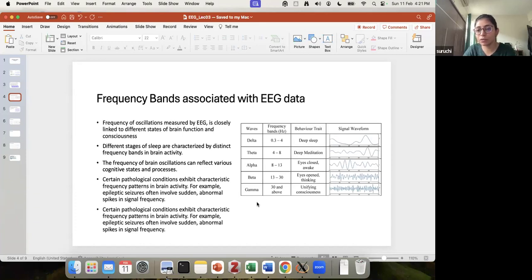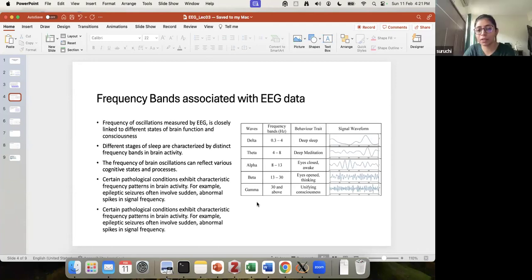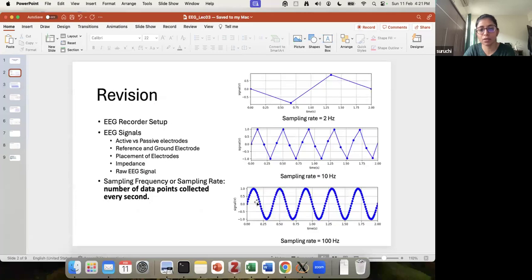So in terms of this, there's nothing to do with sampling rate here? No, nothing to do with sampling rate. Sampling rate is the measurement. Even if you took 10 samples per second and 100 samples per second, it is still 3 hertz. The signal frequency is still 3 hertz in both cases. You just have bad data, so you can't tell the shape nicely. And here you can't tell anything at all. So this is very bad.